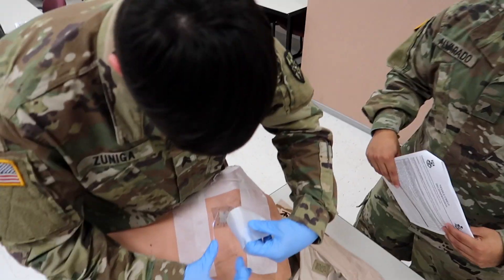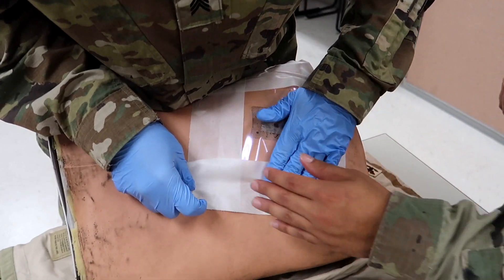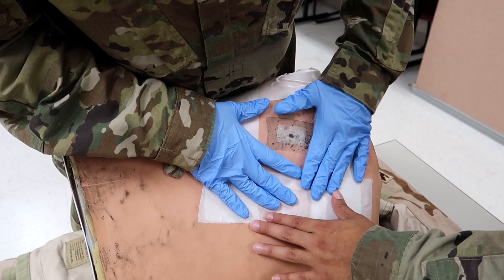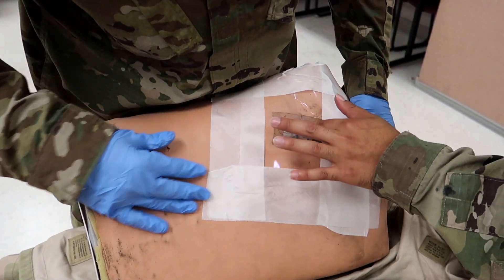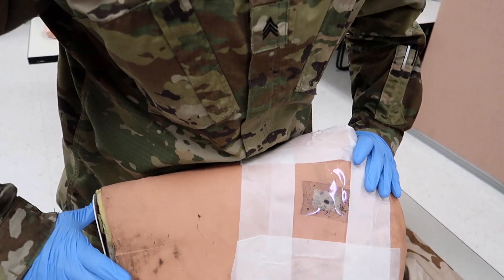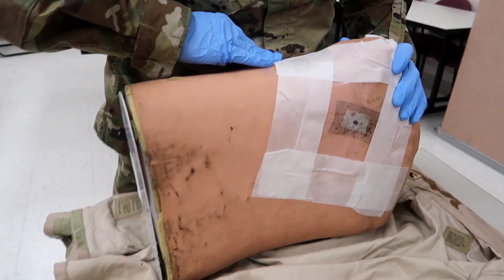As you can see, he's almost done. The tape extends at least one to two inches outside the dressing, making sure it's really adhesive and you can see the wound covered properly. Step: ensure the material extends two inches on all four sides.